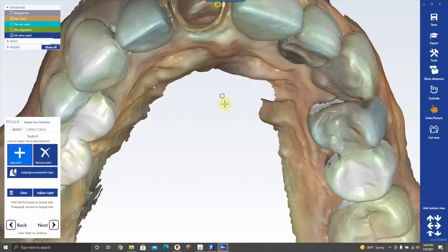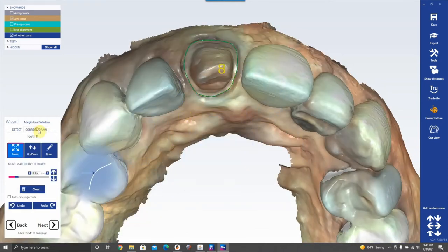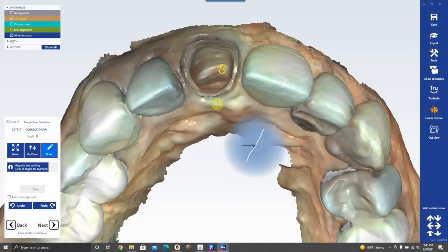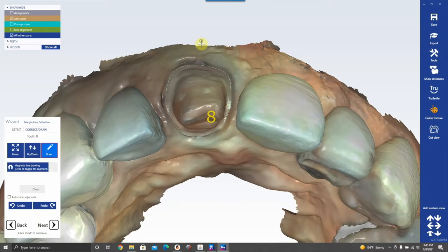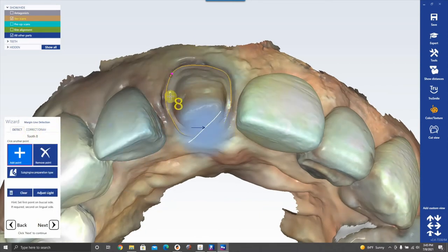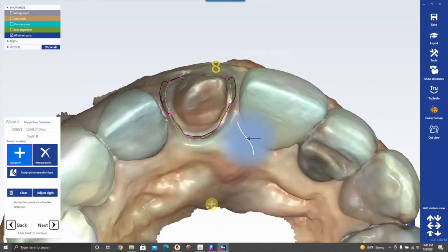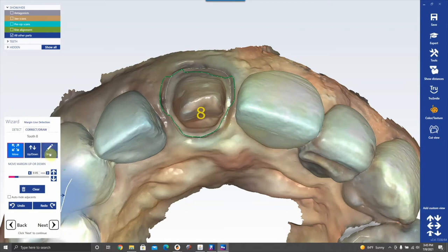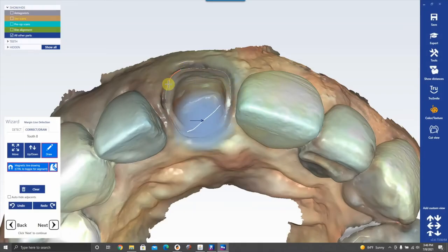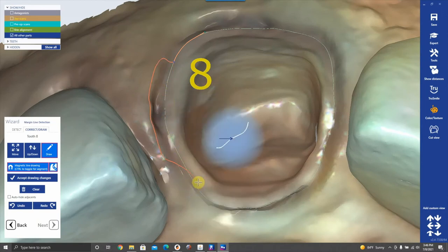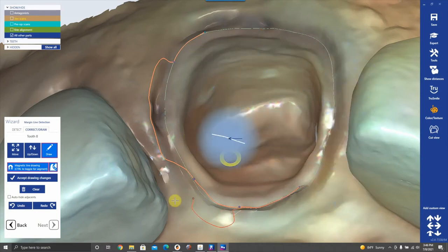Now it's asking me to draw the margin — this did transfer over from PlanCAD Easy, but we'll clear it. It still shows a ghost of the old margin. There are a few options: Detect has you click points along the tooth and tries to find it automatically, but I find it highly annoying. Magnetic is like Lasso in PlanCAD Easy, but it only works when the finish line is already blatantly obvious.